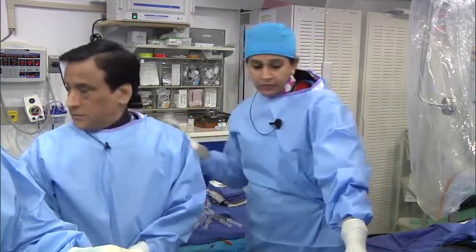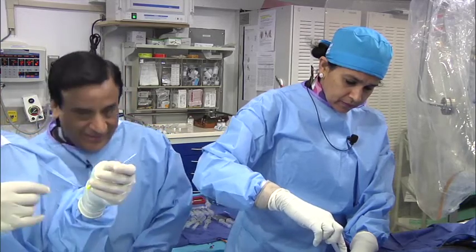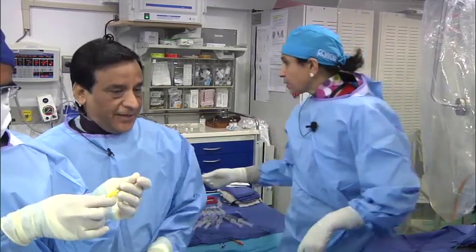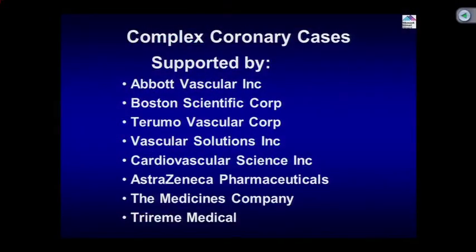Okay. So, as per the demand, another bifurcation case? Yes. And particularly a lot of imaging work being done here. So this is the case. We go to the slide quickly.